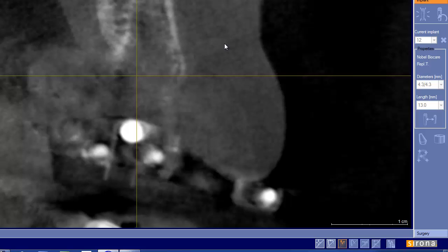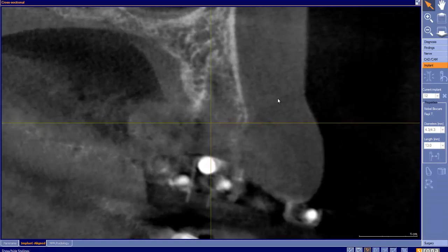Okay, so I'm going to start a whiteboard here, and the first thing I do is outline what I'm seeing. What I see right here is the palatal tissue. The tissue goes something like that. Then I like to highlight the bone as well, and what I see here is the bone is somewhere like that. Now this gives me a visual of what I'm looking at, and a better idea of the bone level and so forth.